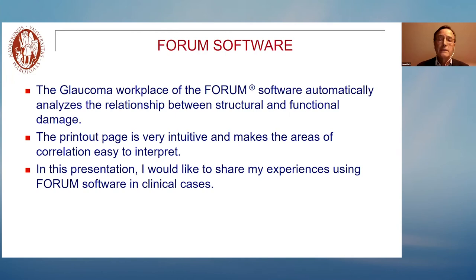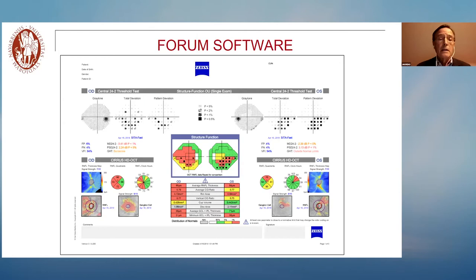The Forum software automatically analyzes this correlation between both tests. In this presentation, I would like to share my experience using this software in some clinical cases. First, in the first part, I would like to show the printed pages of the software, because in my opinion, it's a very intuitive method to evaluate this correlation.